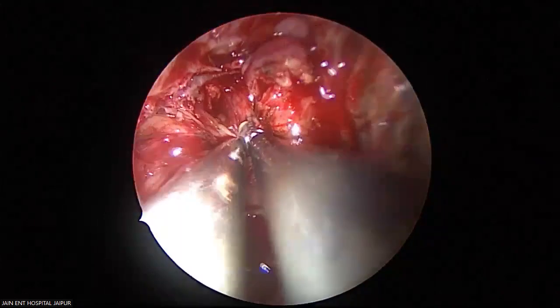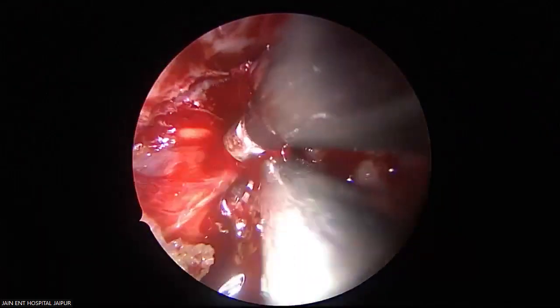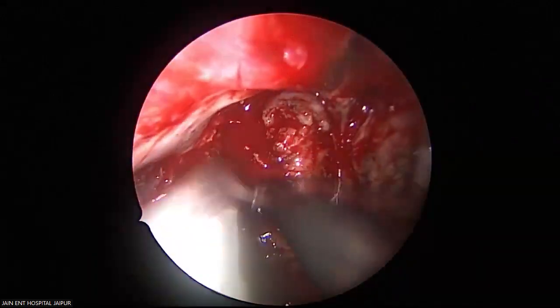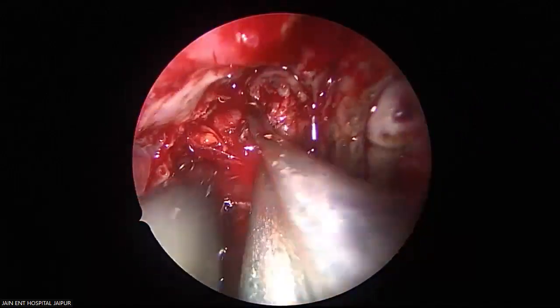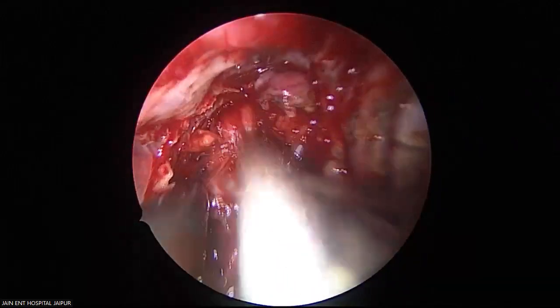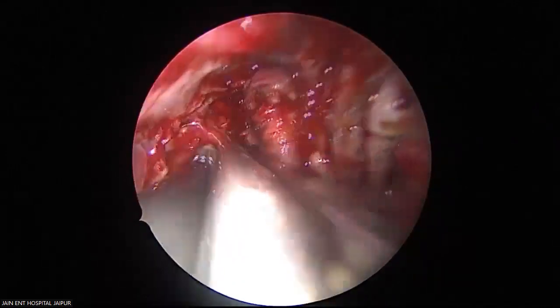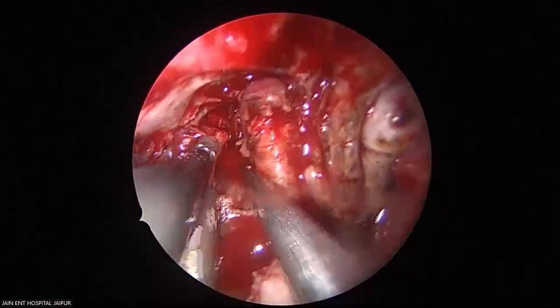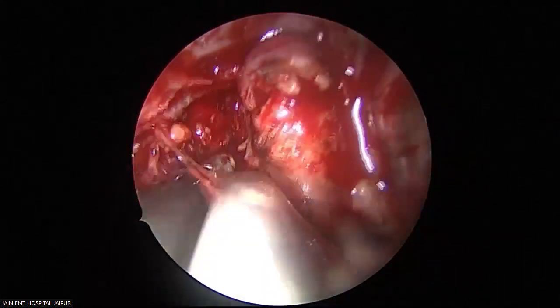Satish, there is a question: when to clip and when to coagulate? I think clipping is a more certain, more secure method. Coagulation of such a large vessel may not be so effective, particularly when this vessel supplying the JNA becomes enlarged.